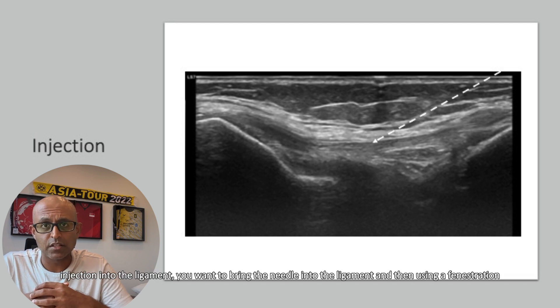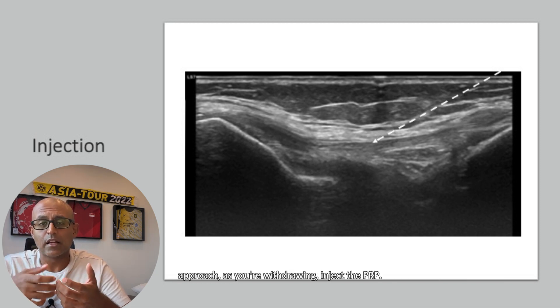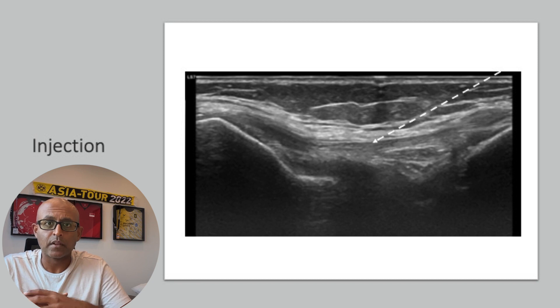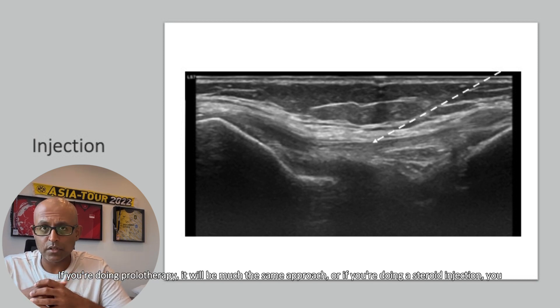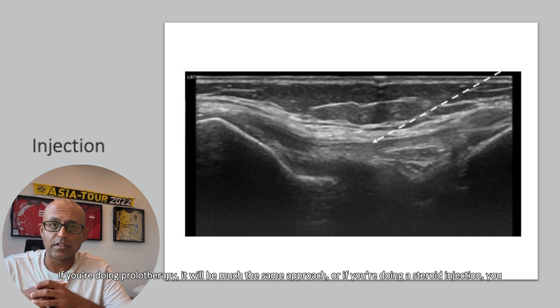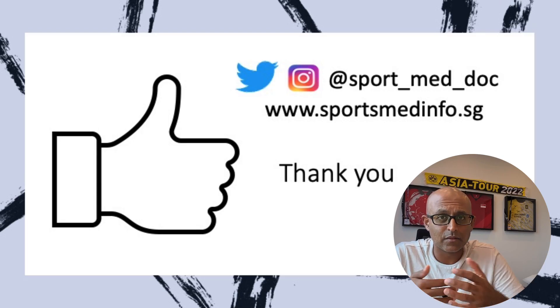If you're going to do a PRP injection into the ligament, you want to bring the needle into the ligament and then, using a fenestration approach as you're withdrawing, inject the PRP. If you're doing prolotherapy, it'll be much the same approach. Or if you're doing a steroid injection, you want to put the steroid as close to the ligament as possible, but not within the body of it.